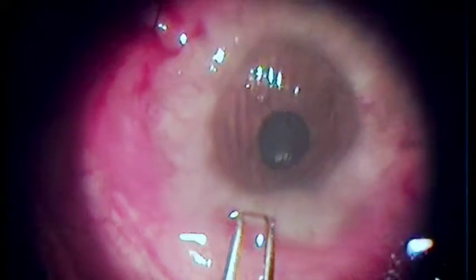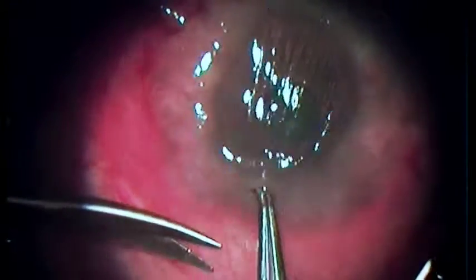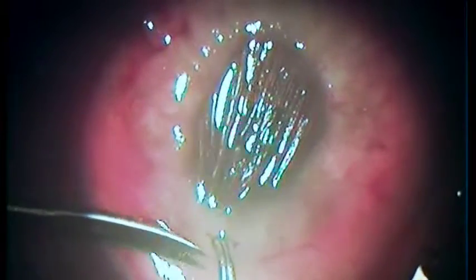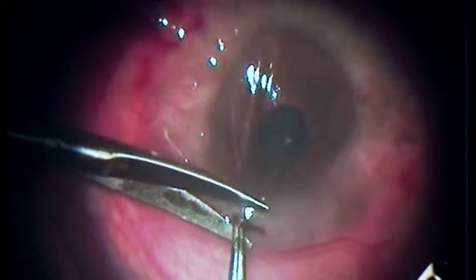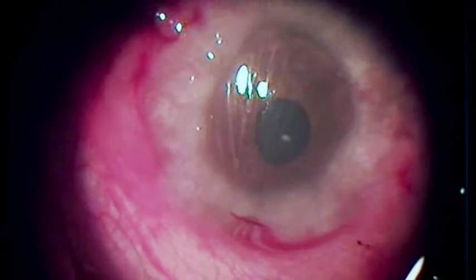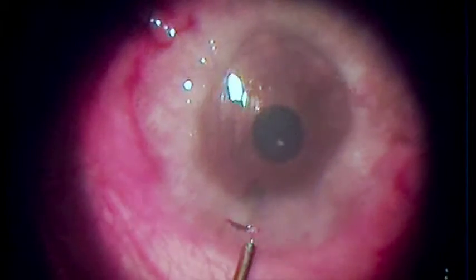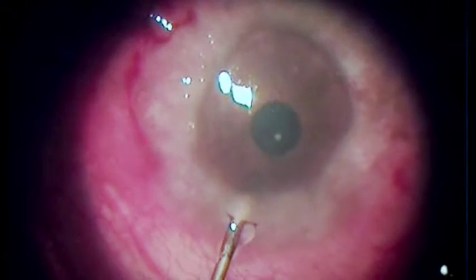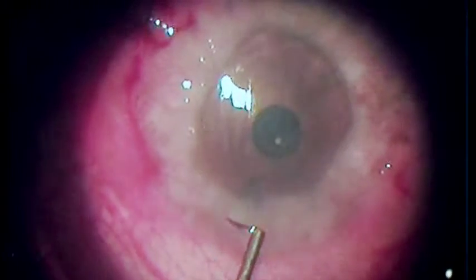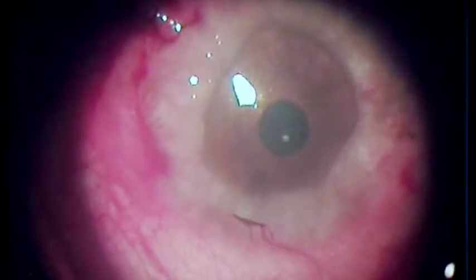The pupil is contracted with a miotic and we are going to do peripheral iridectomy through this 1.5 mm vertical incision, anterior to the two tracts that we just made. You cut the iris and then wash the anterior chamber to remove any pigment or blood or anything. Very nicely done — the anterior chamber is being washed. Then we have to put air into the anterior chamber.